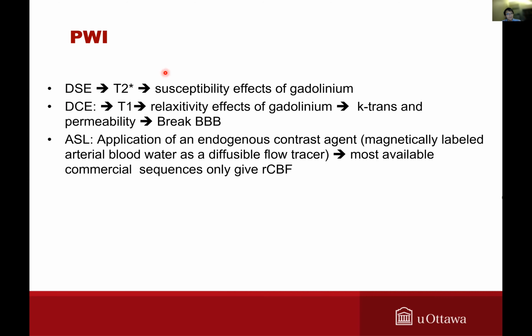the individual, and we're going to see the decrease of the signal intensity in the tissues of the brain with a late recovery. While the dynamic contrast enhancement uses T1 sequences, and what we are seeing here is the progressive enhancement of the tissues that are affected within the tumor. But what we're really looking for is the areas that are enhancing, and these areas that are enhancing represent the areas that have a break in the blood-brain barrier.